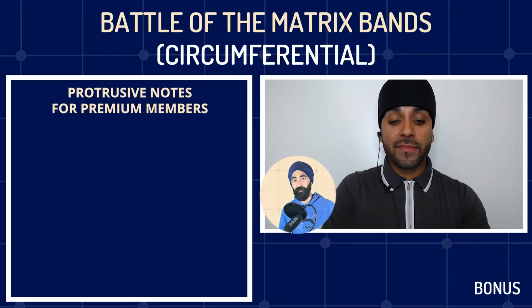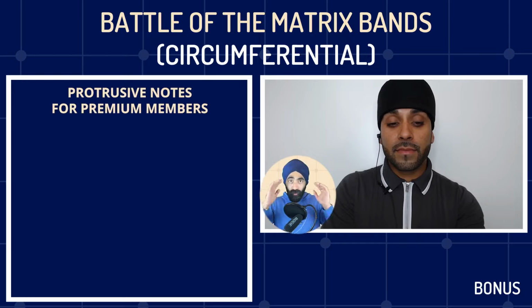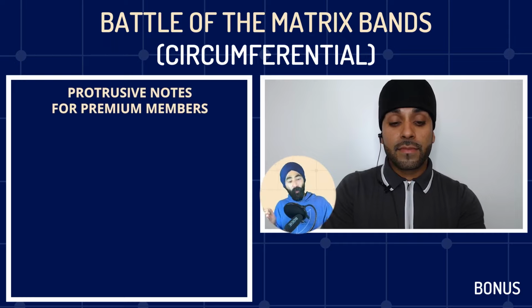We're talking about a really big topic. All the topics we cover nowadays, I just think they're so fundamental. We're talking about circumferential matrix bands, the bread and butter that we were taught at dental school. Maybe now they're teaching sectionals, but certainly when I was training, all we used was a Siqveland, and then a disposable matrix band with clear mylar inside that circumferential band. We did everything in Sheffield at that point, and I didn't even get to grips with Tofflemire. It was just Siqveland for everything. If it didn't work, it didn't matter. That's all we had.